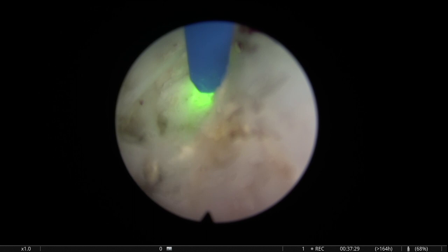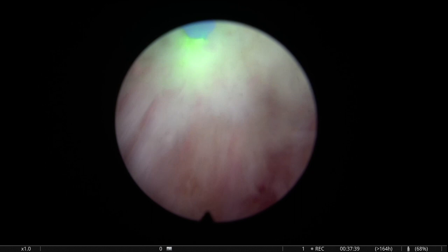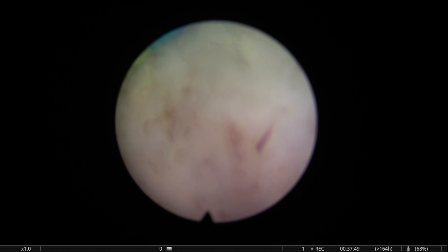It's important to remember that you cut with the light, so you don't cut with the fiber. You shouldn't be using the fiber as a sword to cut the tissue, because it won't cut it. Sometimes you get a little bit closer trying to get an enhanced cutting effect, but the truth is that it is the light that has to cut the tissue and not the fiber.